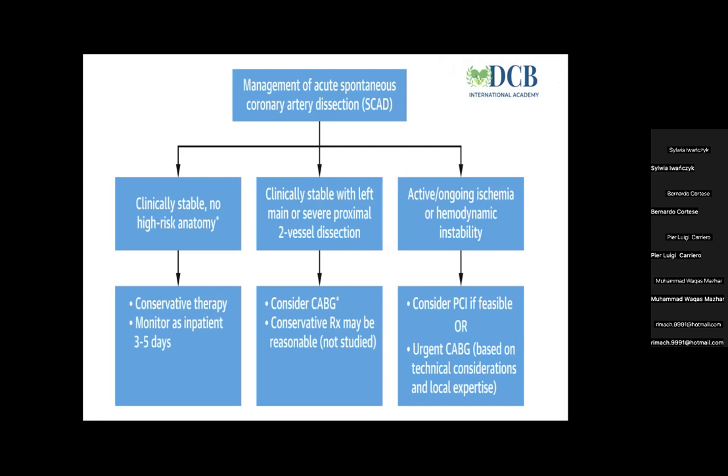The problem with dissection is that, again, you see just the impairment of the lumen angiographically, but you don't see the extension of the dissection in the vessel. So even if this is out of any guidelines, if it's feasible and if it's not risky for the patient, you should do imaging just to see the propagation of the dissection.